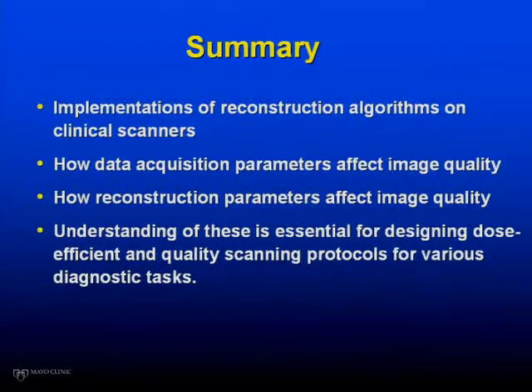How can the iterative reconstruction algorithm help reduce the cone beam artifact? In the cone beam artifact? Yeah. I would predict, but I don't have any example, because the cone beam artifact originates from the analytical reconstruction.